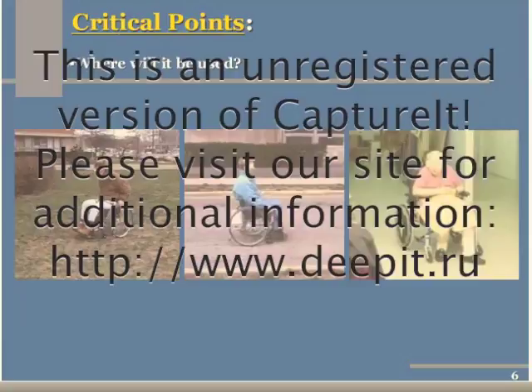Will they traverse uneven grassy terrain like our young woman in the slide on the far left, and concrete like the woman in the slide in the center? She was planning to attend a large rural college campus, so during the evaluation, she tried the chair outside on the grassy area in front of our building. Sure, it's an urban setting, but that grassy area is hugely uneven and very much a variety of dirt patches, gullies, and thick grass. As an aside, the woman in the center slide is the mother of the young woman on the left. Because she was such an integral part of the evaluation and decision-making process, we thought it would be beneficial for her to try out the chairs on the same terrains that her daughter would need to traverse. This helped her assist her daughter with the final decision regarding the base.